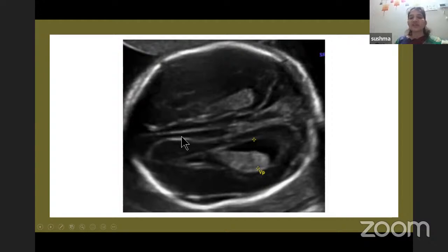These two lines are not CSP, but these are the medial border of the frontal lobe of the cerebral hemisphere. But these two cerebral hemispheres that are to be connected by CSP are not connected together.